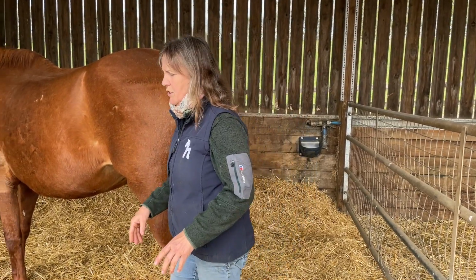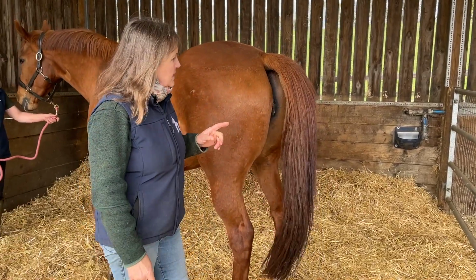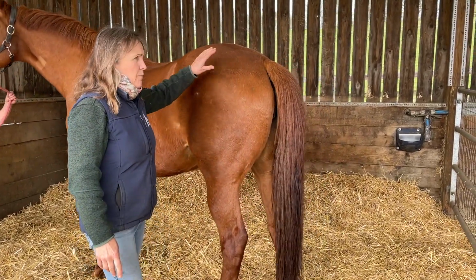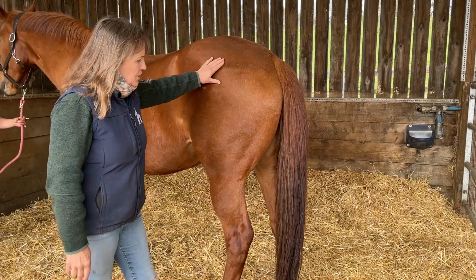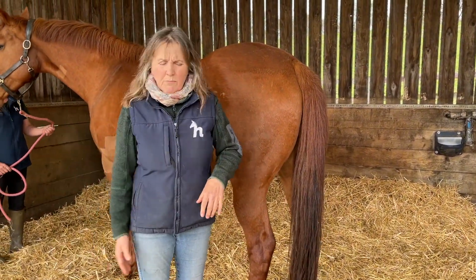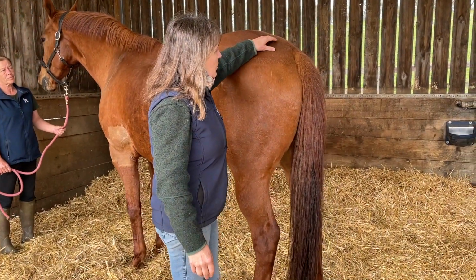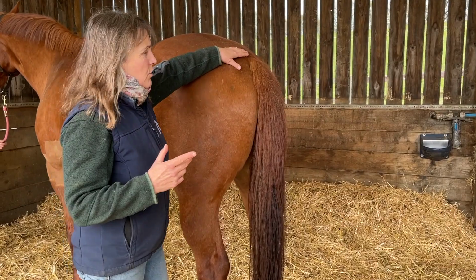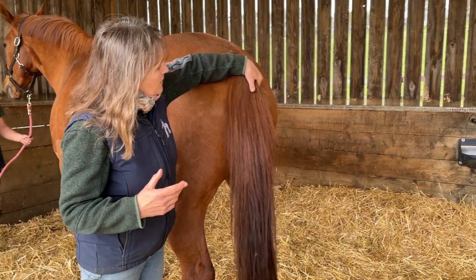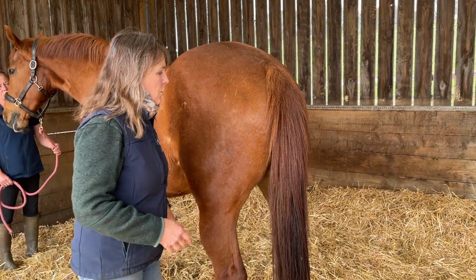I'll just move position. You've got a couple of options for actually lifting a horse's tail, and she is used to having a temperature taken. She's had a temperature taken before. She's got a little bit disturbed and bothered there by the horses pawing at the gate for attention. But you've got a couple of options, and certainly with a big horse it makes sense to draw the tail to one side. Now she's clamped it a little bit there, and I'll talk about it.